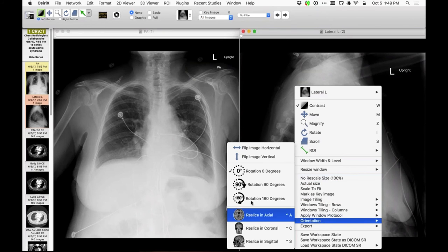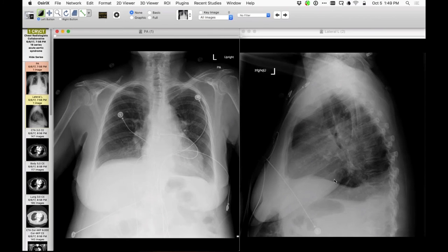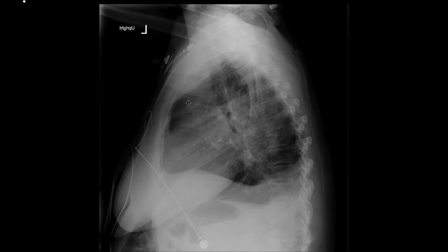Orientation, like that. So we have pleural fluid, and at initial glance, I think one can see a lot of pathology. Let me just show you the frontal for a moment, because pleural fluid is not that interesting. Let me bring up the lateral, which I think is particularly interesting. I'm going to do a region of interest to indicate where there's a lot of pathology. I'm going to call this, flippantly, the red rectangle of really badness in there.